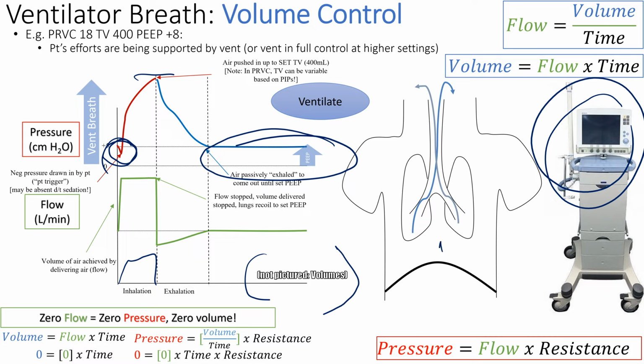Okay, and if you pay attention, your diaphragm goes down and it's going to accommodate this positive pressure inside the chest. Okay, so the patient's efforts are being supported by the vent, right? And sometimes the vent's in full control, and we need to provide sedation to help oxygenate the patient. Okay.